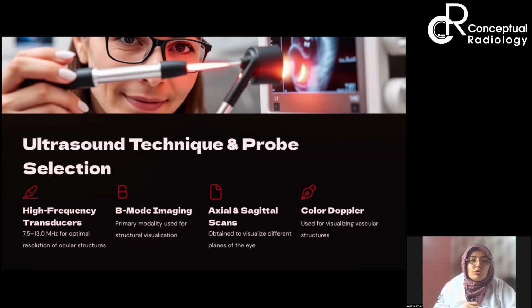After B mode, then you can always apply some color Doppler. So save it for next step में color Doppler. Axial में and sag में, always you have to see in two planes. So एक short axis में, and then you have to also hold your probe longitudinally, axial as well as sagittal. ठीक है, so I hope everyone is fine with this.